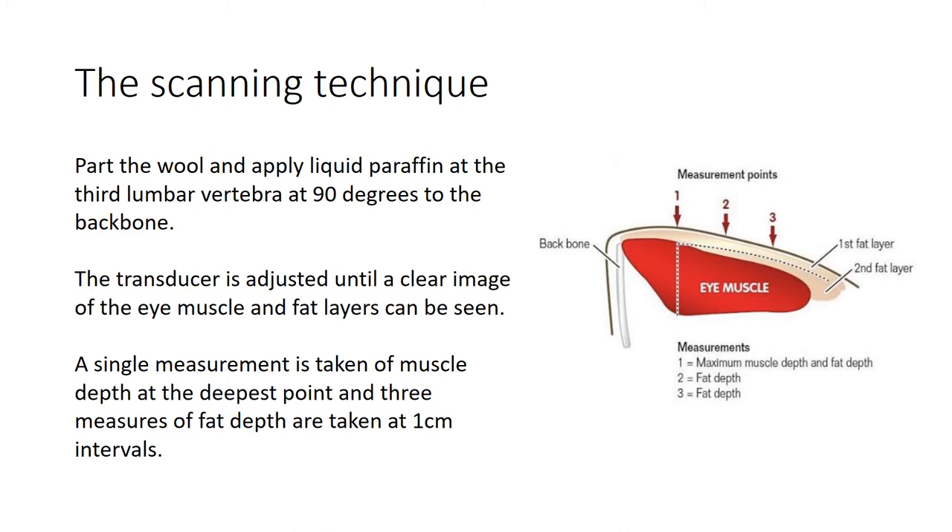To recap the scanning technique: you're parting the wool, applying liquid paraffin at the third lumbar vertebrae, and positioning the scanning head 90 degrees to the backbone. You'll then adjust the transducer slightly - moving slightly backwards or forwards - until you get a lovely crisp image, then freeze it on the machine. We take a single measurement of muscle depth at the deepest point, then three measurements of fat depth at roughly one-centimetre intervals moving away from the spine - the fat measurements typically get thicker as you move away from the spine.